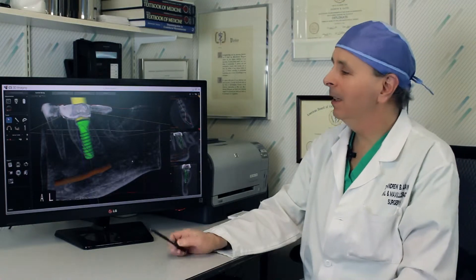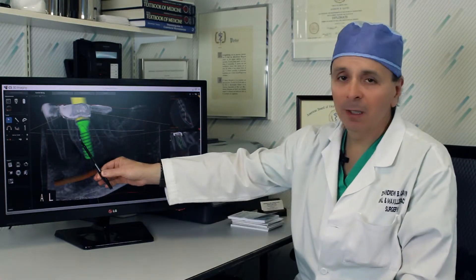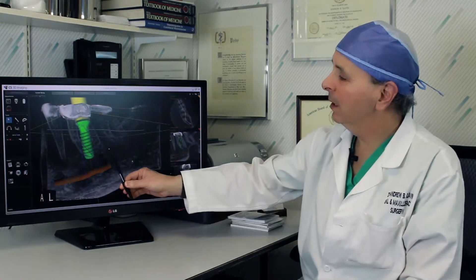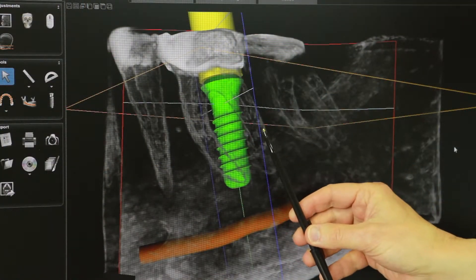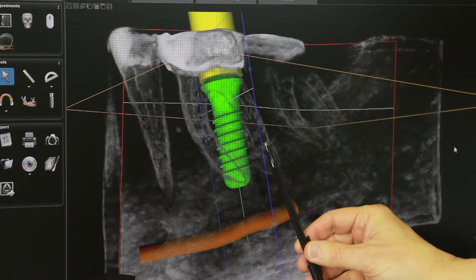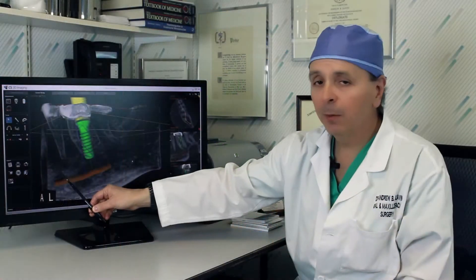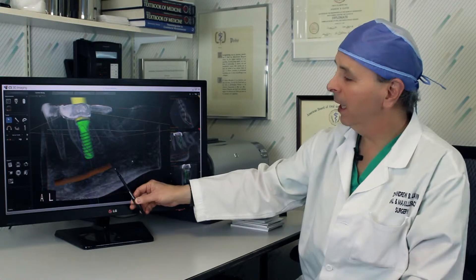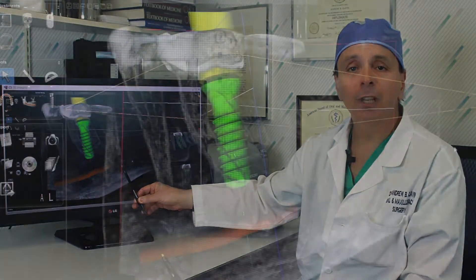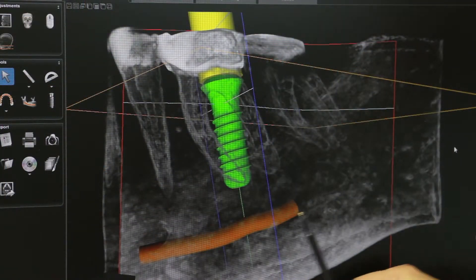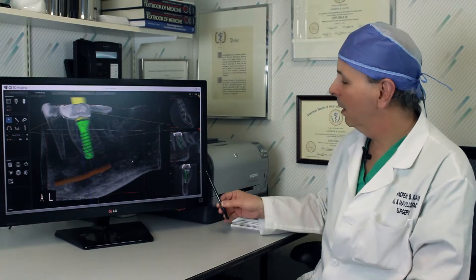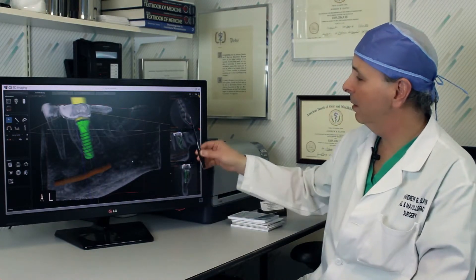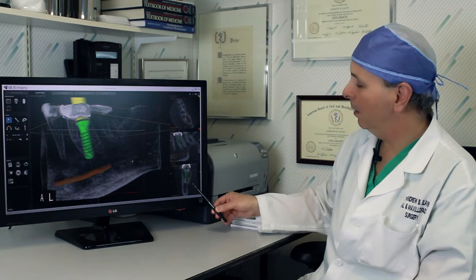What I'd like to show you today is this image of a patient's lower jaw bone. As we can see, this tooth is a problem tooth that needs to be removed, and this implant can be placed virtually on the screen. The nerve which runs through the jaw bone — the one that's numbed when you have a shot of Novocaine that makes your lip numb — is a critical structure. The implant has to be shorter than this to avoid damage to that nerve. We can see this implant in three dimensions, as we can the tooth and the nerve.